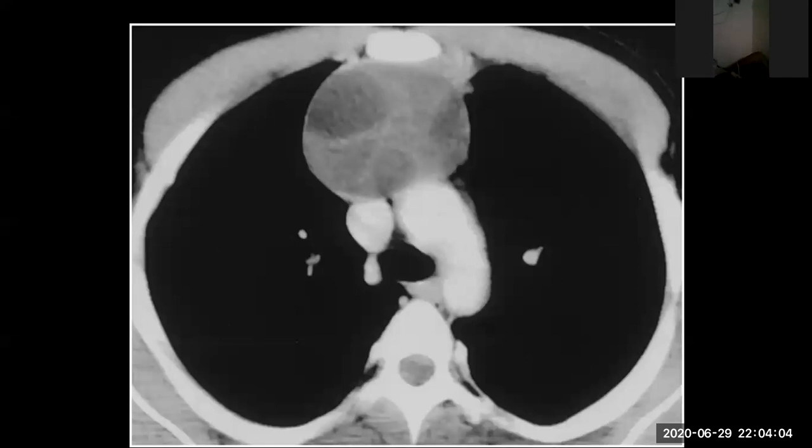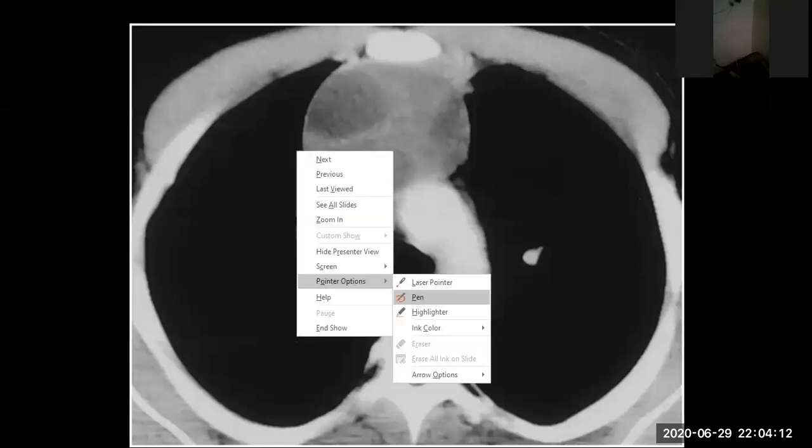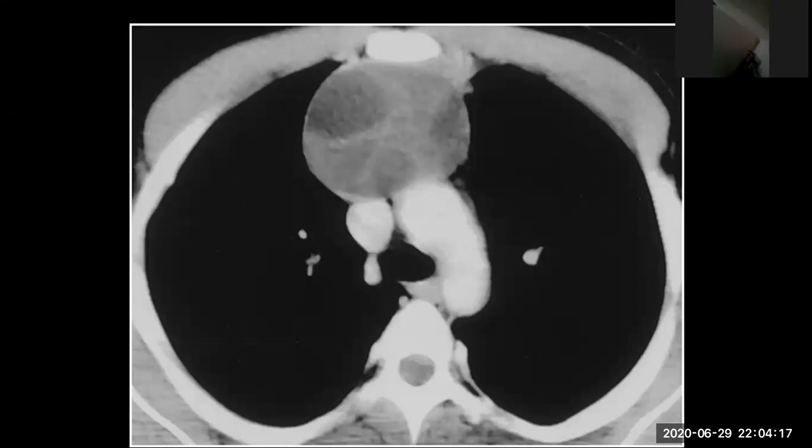Okay, these are enhancement, it is okay, but I don't think these are enhancement. Okay, ماشي كمل مش مشكلة. With mostly fat content. This is fat. It is the same fat as here, or a little bit different. Yes, it's more hypodense than this one.